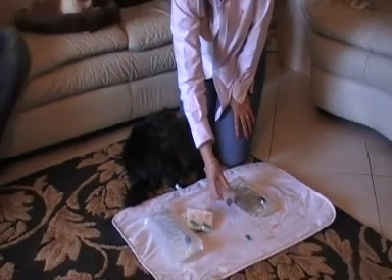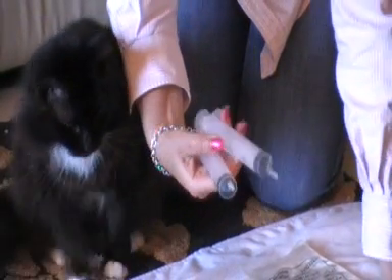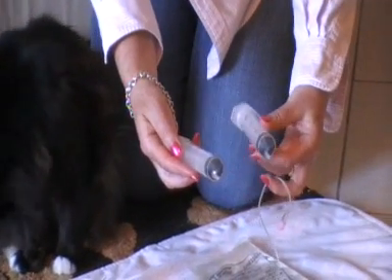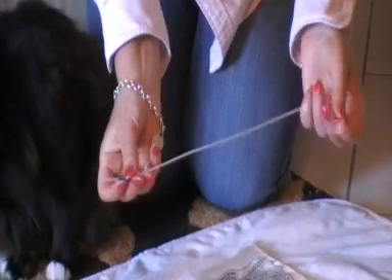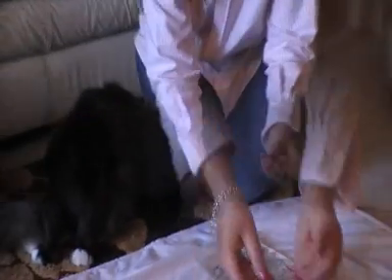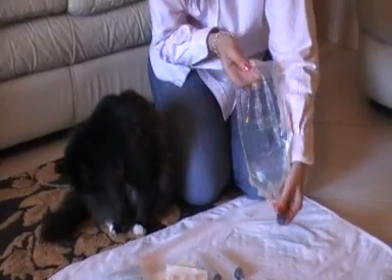Then we need two syringes — empty syringes — for putting the fluids in. This is a 30ml; either two 30ml, or a 40ml and a 30ml, but you need two of these. And this is what the butterfly needle and the tubing looks like when it's out of its packet, with a little cover on it. You'll also need one needle for drawing the fluids out. This is a bag we've already been using that's out of the packet.